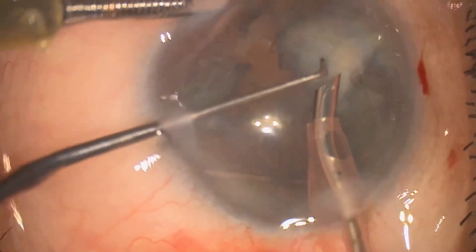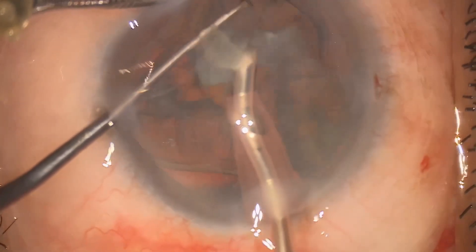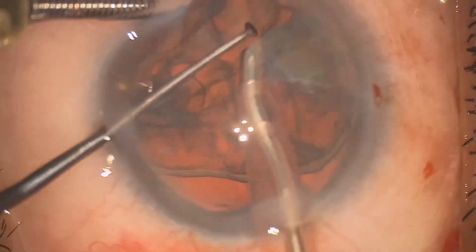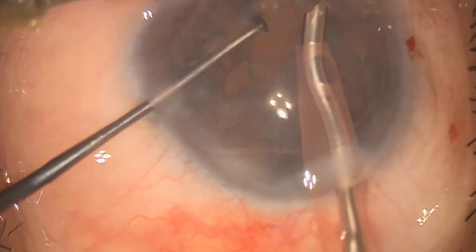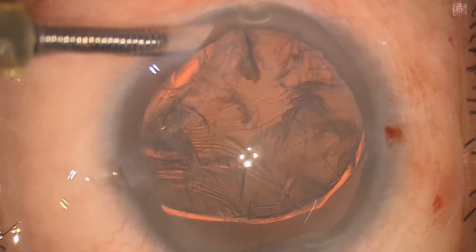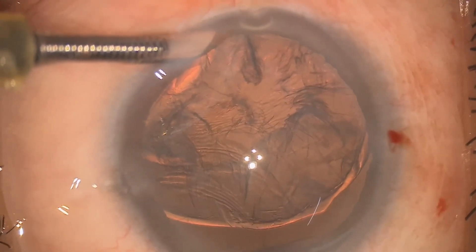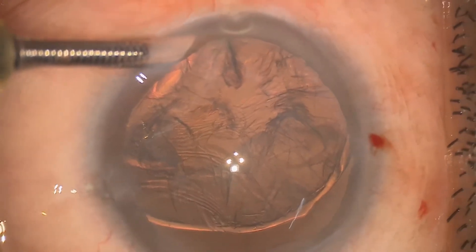Now when it comes to the last portion of the nucleus, as you can see the posterior capsule is very lax because of the zonular weakness, so maintaining the anterior chamber IOP is very important. For this case we have put the AC maintainer, so for us it was not much of a worrisome point, because the IOP was not much fluctuated during the FACO.